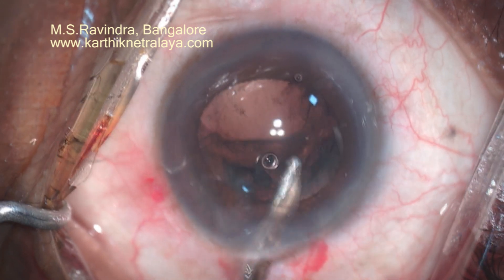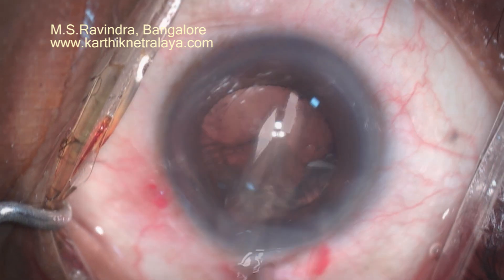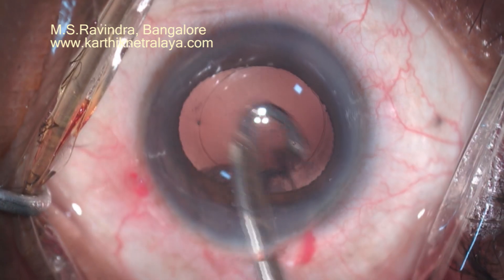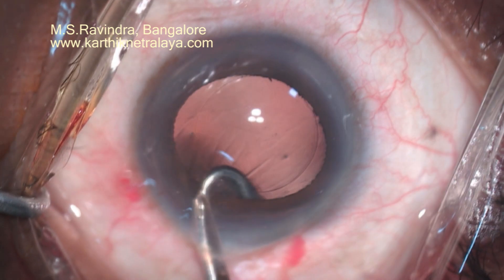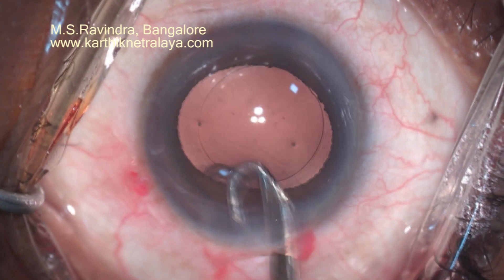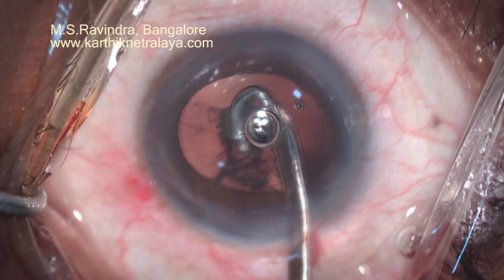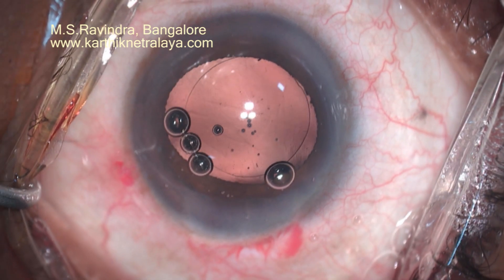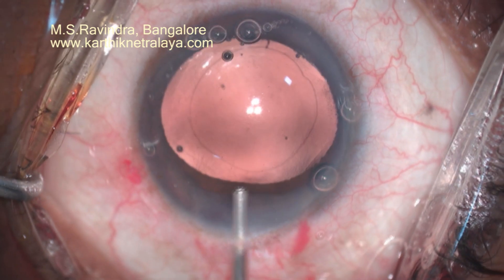After complete cortical aspiration through the main port — it has to be the main port because there are no side ports here — the IOL is implanted. The sub-incisional cortex is removed by left and right J-shaped Simcoe cannulas. These cannulas are mounted on a silicone bulb so that you can control the amount of infusion of fluid into the anterior chamber to control the depth of the chamber.